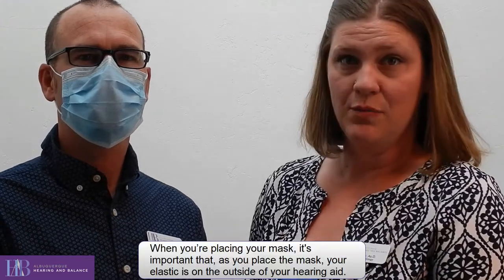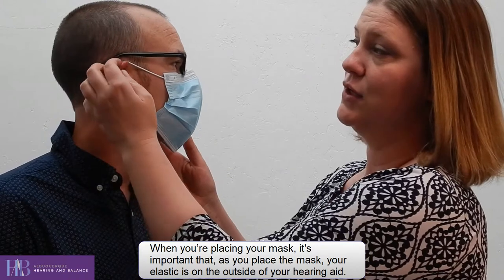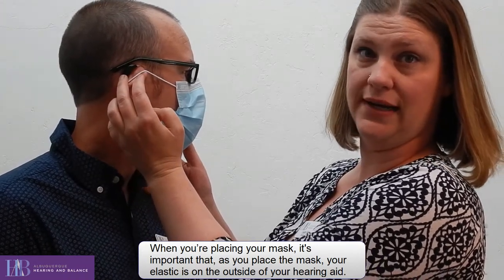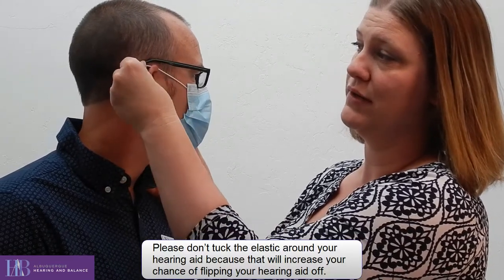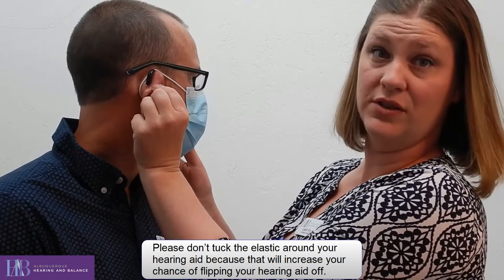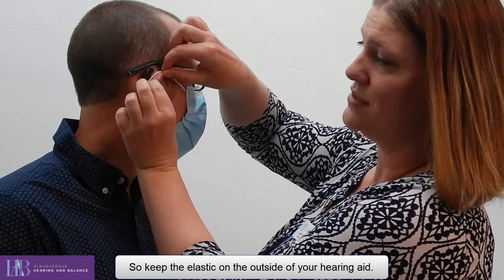When you're placing your mask, it's important that as you place the mask, your elastic is on the outside of your hearing aid. Please don't tuck the elastic around your hearing aid, because again, that will increase your chance of flipping your hearing aid off. So keep the elastic on the outside of your hearing aid.